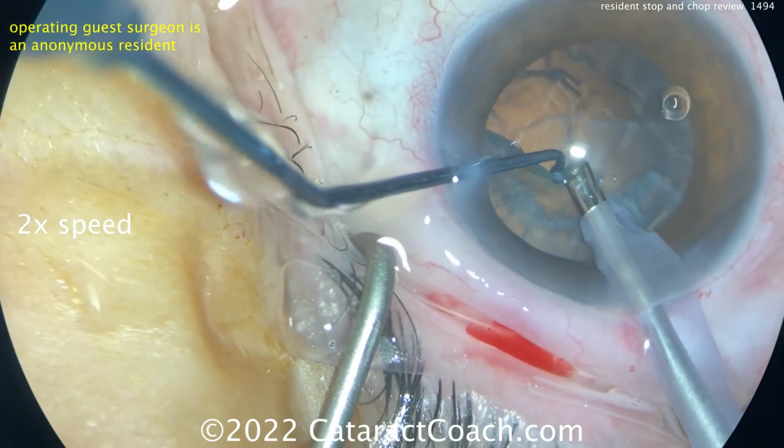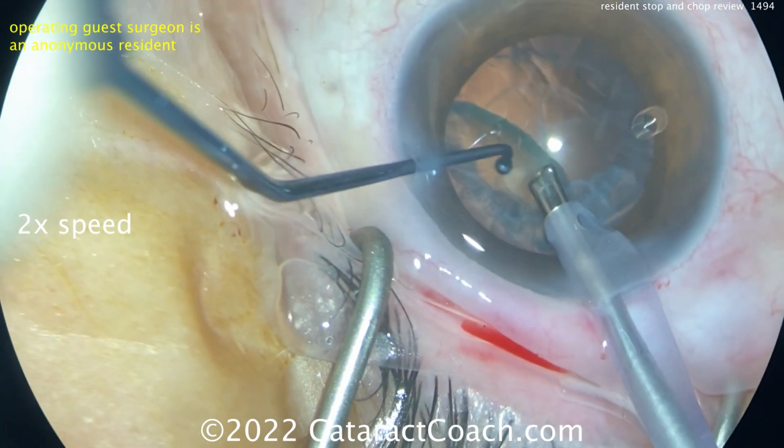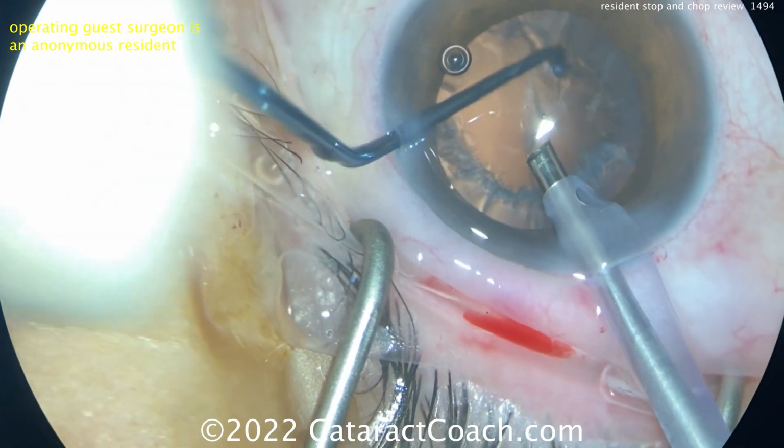So let's end it here. And next time, please, when you send a video in, young residents, make sure, hold yourself to a higher standard. Yes, do a good job like you're doing here, but keep the eye in the center of your operating field.